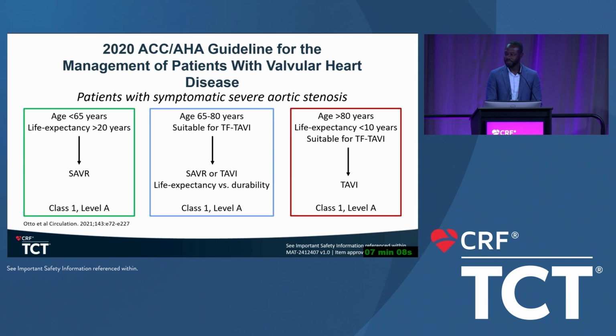I think it's one of the most important things when you're in there, and why it's good to do it all together, because you're thinking about all these things in the future. We're very cautious when we talk to patients about this, and we often say, we think we can place this valve in a way that we can come back and do another procedure, but there are different levels of precision in what we can do.